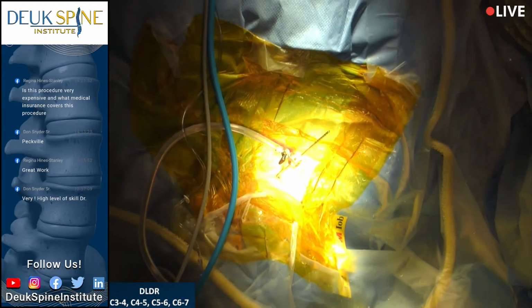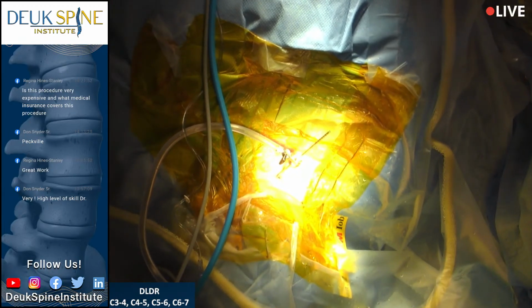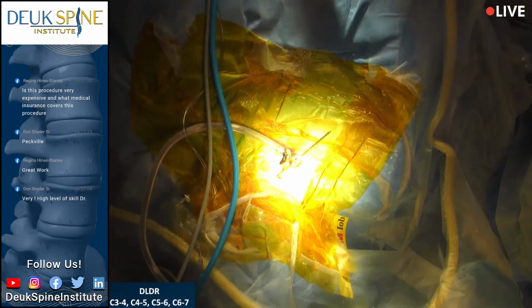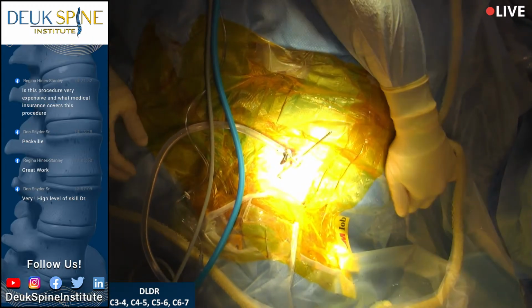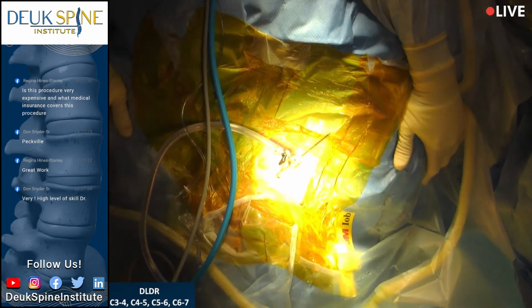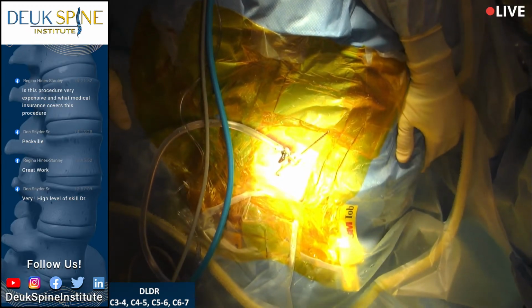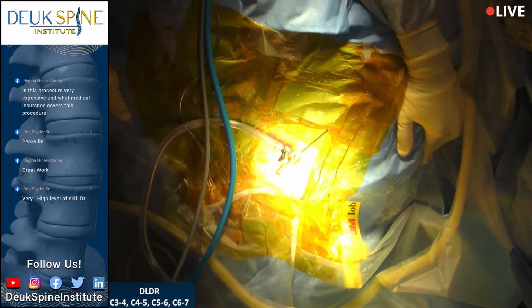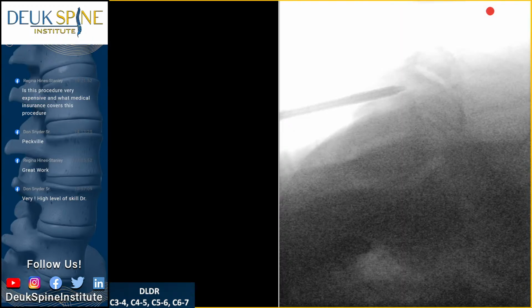I'm not saying there's anything wrong with it. I just want to know if you're happy with it. Just a smidgen. All right. All right, now everybody get in pulling positions, inline traction, please. And the first thing I'm going to do is I just want to see if we can see that 6-7 disc, because that's going to be the determining point. And I think we can, right there. So I think we should go for it, guys. All right, everybody stay where you are. Here we go.